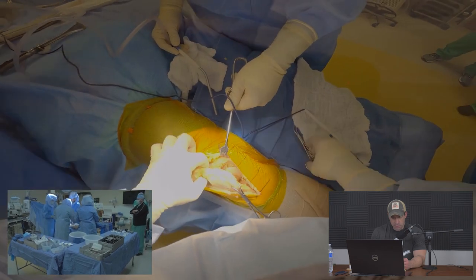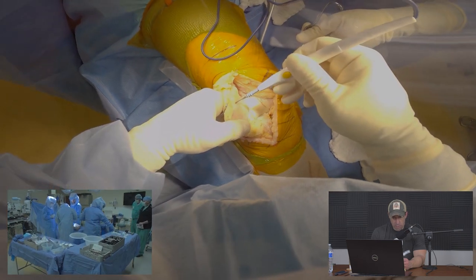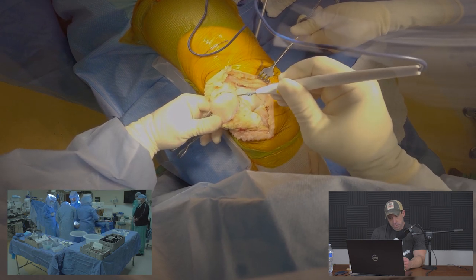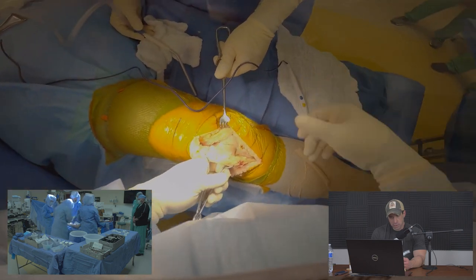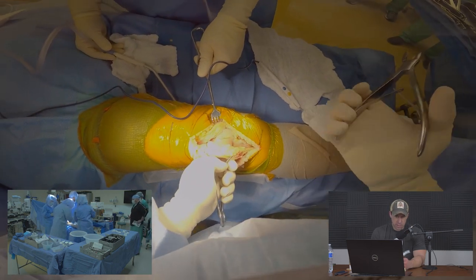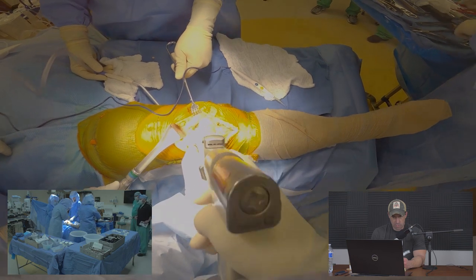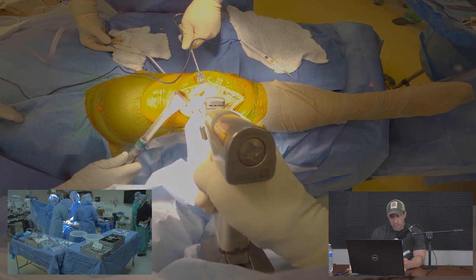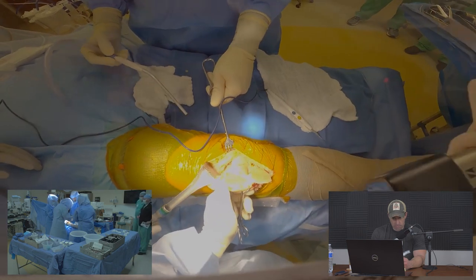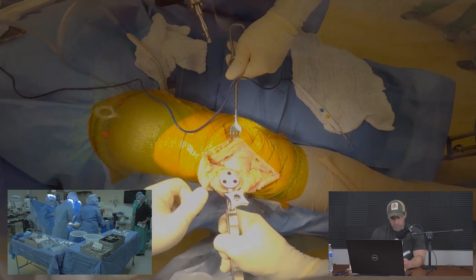Using two clips to hold the patella, we release soft tissues around its edge — a step thought in some circles to denervate the patella and reduce pain. We're taking away bone spurs from the patella, defining its anatomy, feeling the posterior surface to confirm the correct plane, and then cutting away the worn cartilage and surface on the posterior patella, feeling to ensure a flat cut. We then apply a device to prepare for the patellar implant.